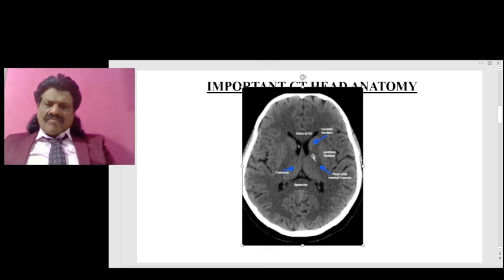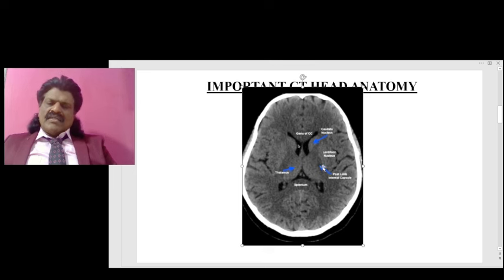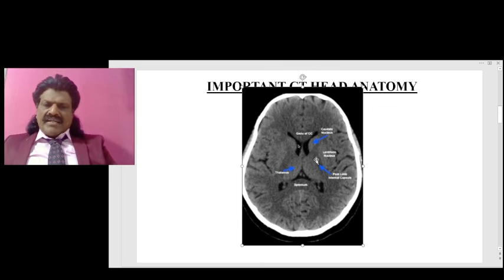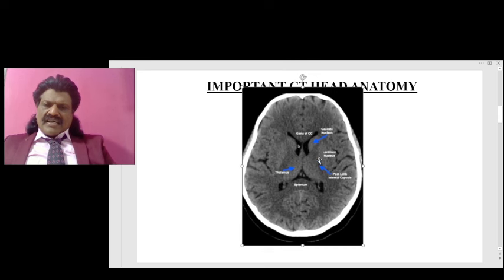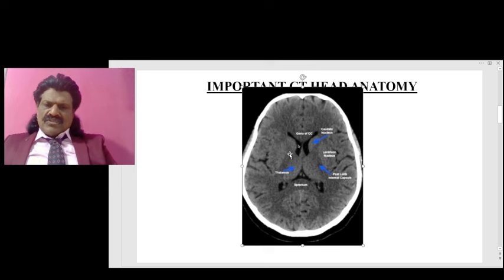In the genu we have the corticobulbar fibers, so when the corticobulbar fibers get affected the face gets affected more commonly. The most important part of the internal capsule is the posterior limb, where we have the corticospinal fibers and the thalamic radiations ascending. Beneath it are the optic radiations and the auditory radiations. This is the anterior limb, this is the genu, and this is the posterior limb of the internal capsule.